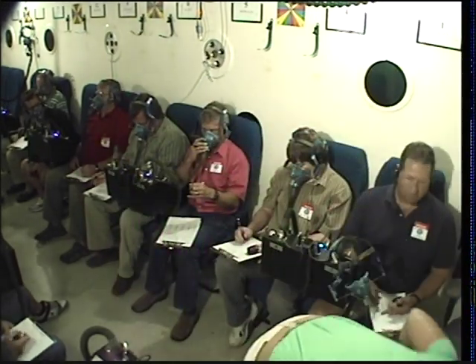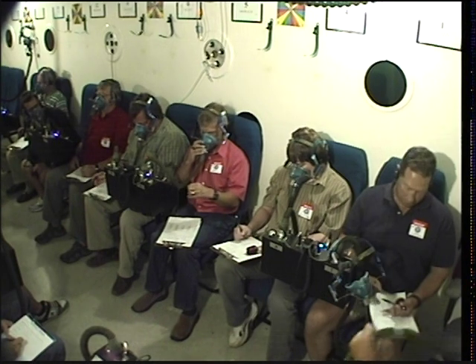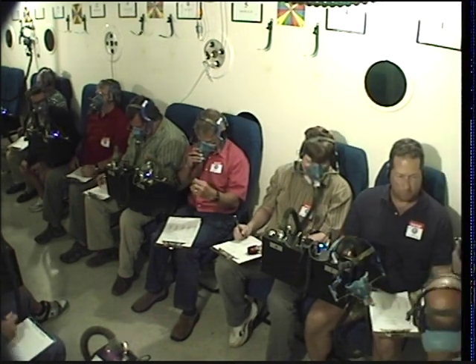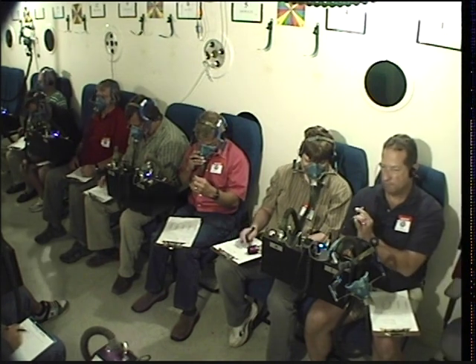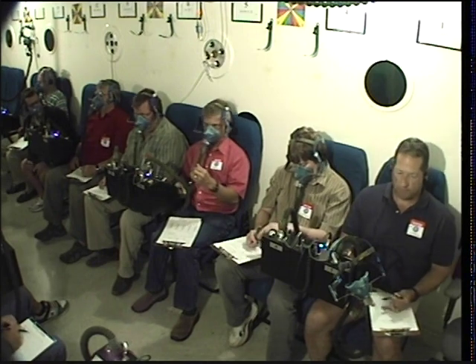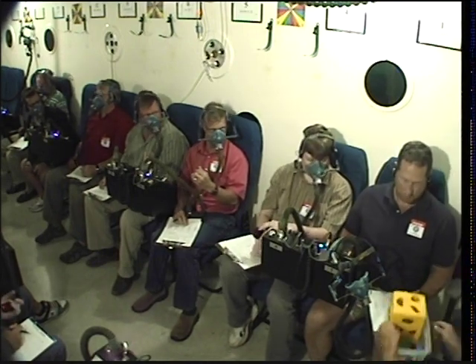Okay, Brian, how are you doing? How many symptoms do you have? Show JR your pulse oximeter so you can see where you're at. He's 66. He's doing good. He's an animal. All right, why don't you give him the toy? We'll just let him finish Don's work.